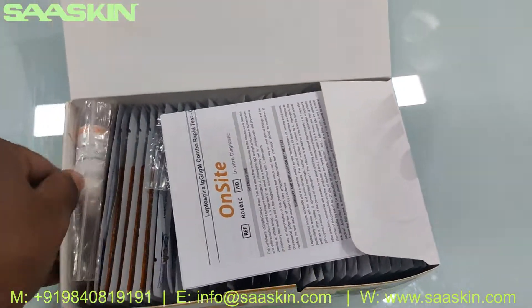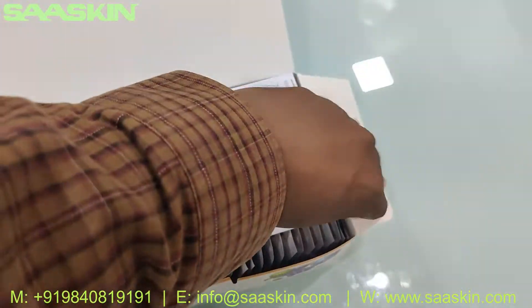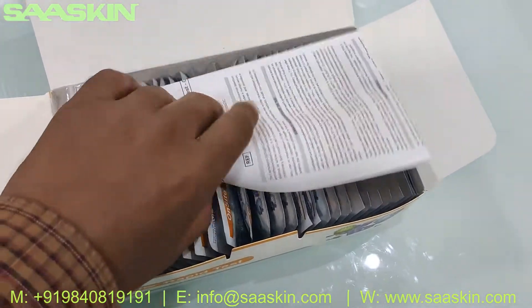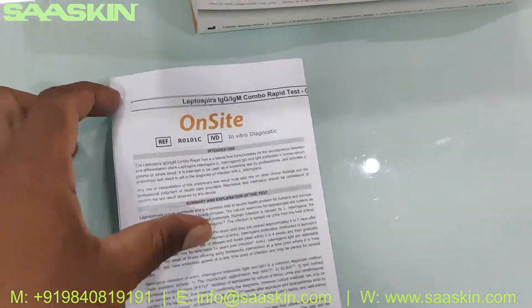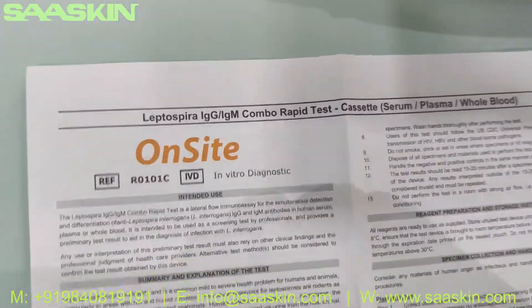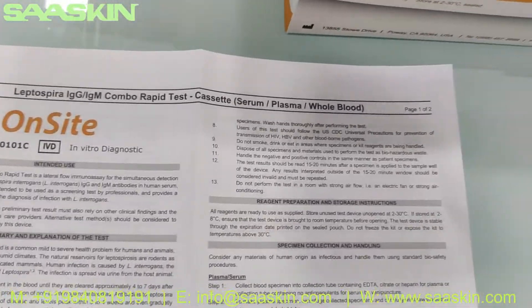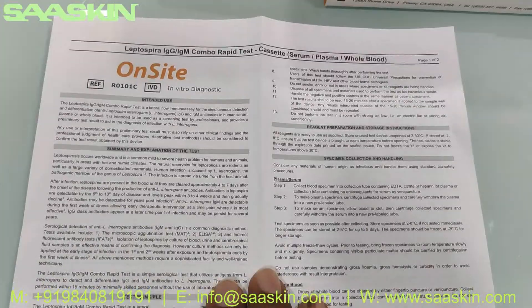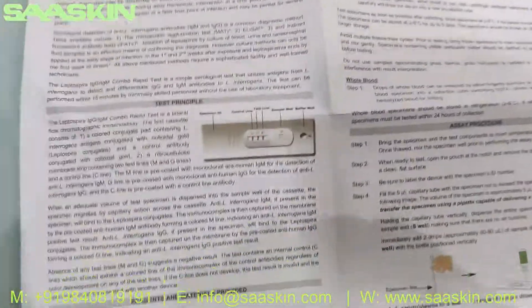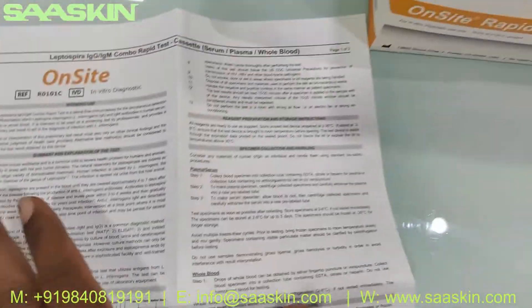This is the inside of the box. Here is the IFU brochure — a complete IFU brochure. So you get the sample preparation, just how to conduct the test, and also how to interpret the results. You get the complete procedure here.